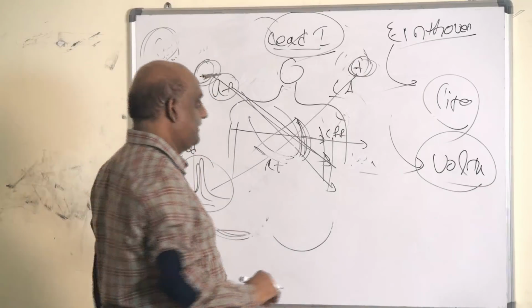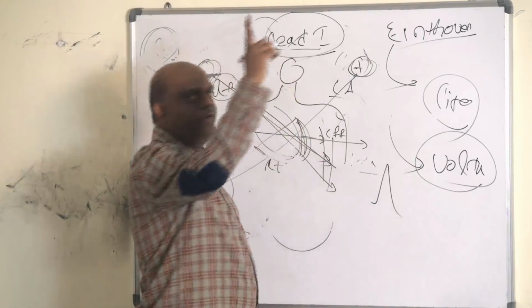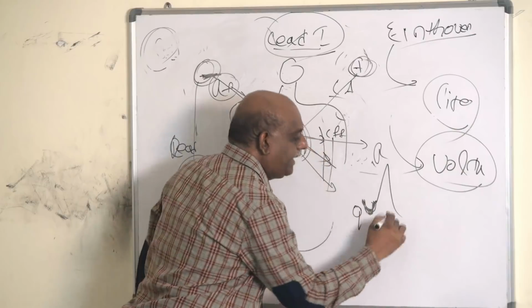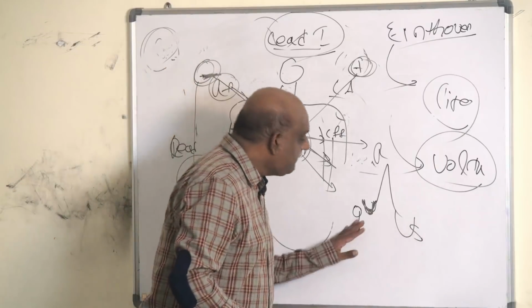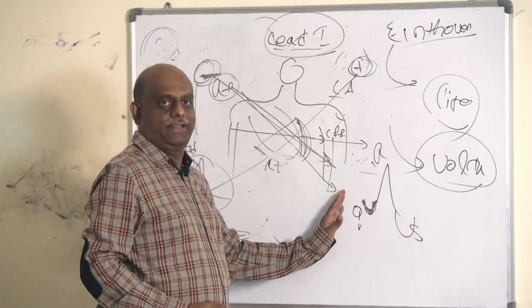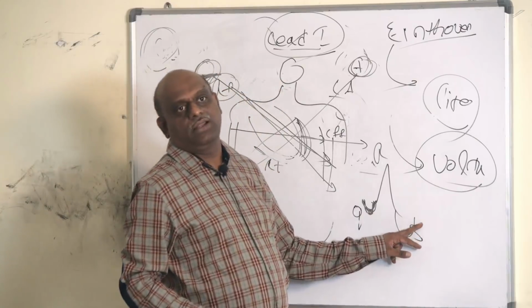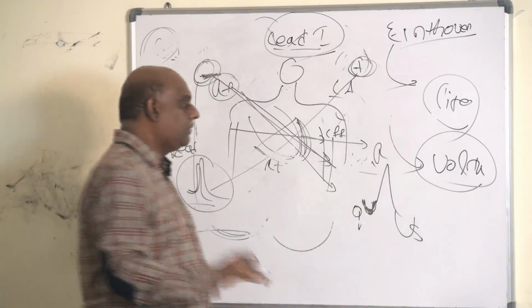Once more, no confusion. What is this positive QRS, negative QRS? Very simple. Any positive wave is R wave. Before that, whatever negative wave you get is called Q wave. This is R wave. Any negative wave that follows the R wave is called S wave. You may not always have an S wave and Q wave, but a positive R wave, a negative wave preceding it is called Q wave, and a negative wave following the R wave is called S wave, is what you have to emphatically remember, doctor.